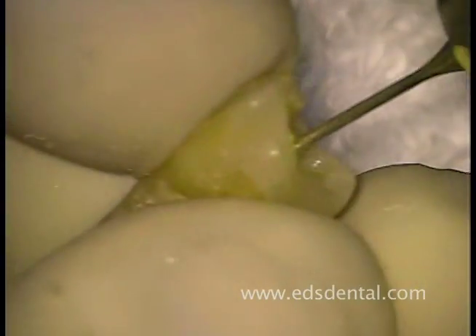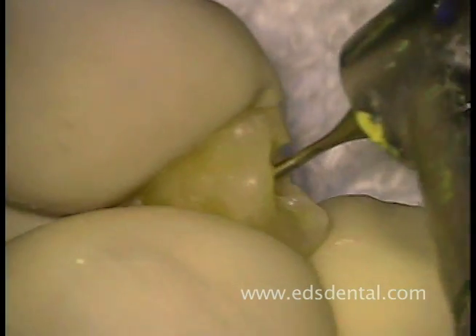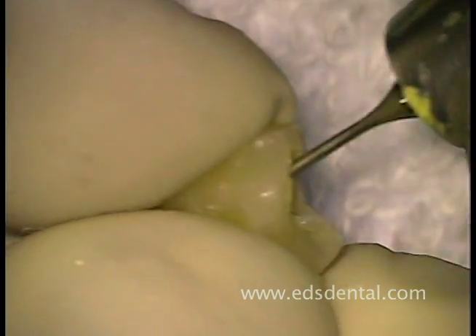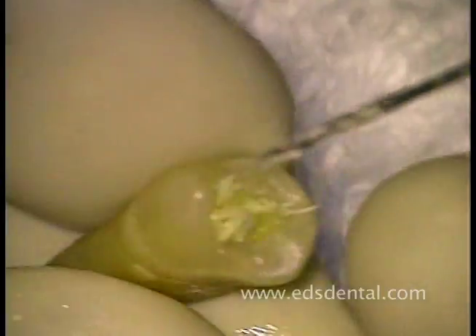Once the canals have been opened to a 20, we widen and straighten the coronal two-thirds of the canal with the tapered Peeso, used with a slow-speed handpiece rotating at approximately 1,000 to 1,500 rpm.